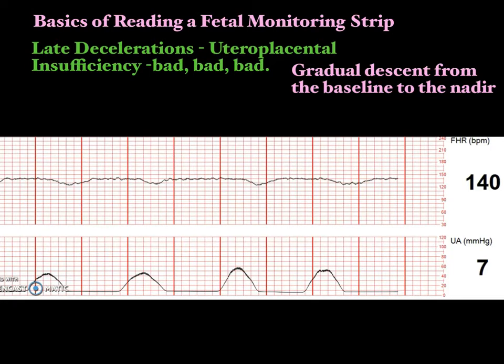Sometimes you'll see this pattern. Patient has an epidural and their blood pressure drops. Remember that I said that back when we were talking about maternal trauma, and I said, well, eventually you're going to want to get fetal hearts because you know what? They're sometimes the most sensitive indicator of what's going on with mom. The baby will show signs of stress. So when mom gets an epidural and her blood pressure drops, before she gets symptomatic, baby gets symptomatic.